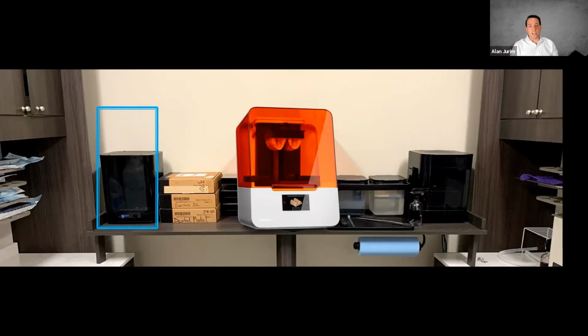Most of the time we'll cure the materials to 60 degrees Celsius, as given to us by Formlabs as the manufacturer. Whenever we take a print off the printer, we'll also start the cure box, the light oven, so that it begins preheating and gets warm. It saves a little bit of time going from the bath, once it's done being rinsed and dry, into the cure box. The cure box is already warm and ready to go.